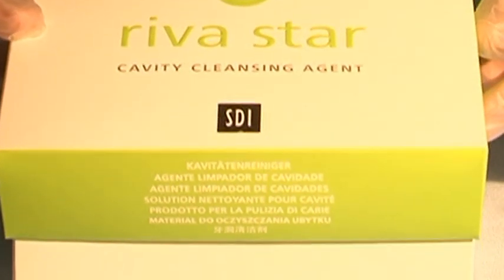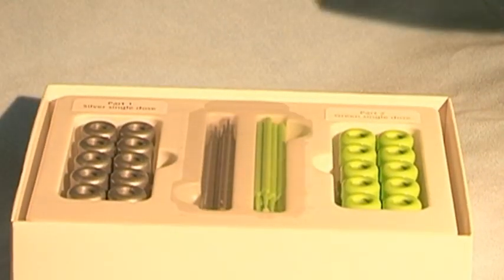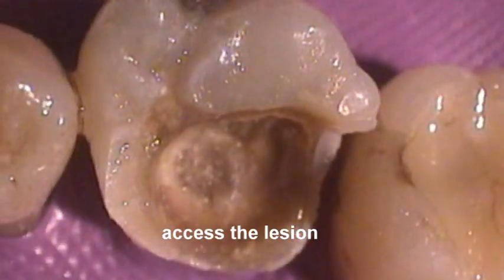Riva Star Silver Fluoride and Potassium Iodide. Open the tooth to gain access to the caries.